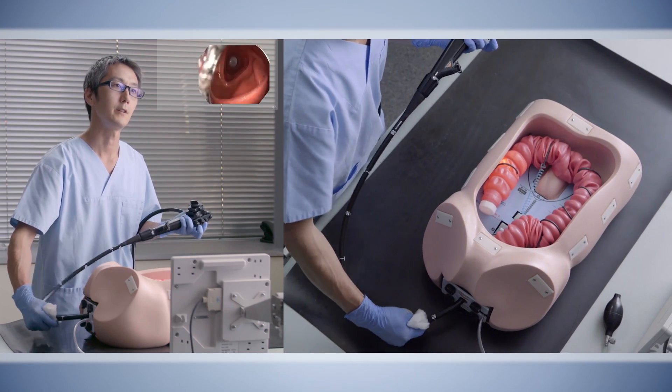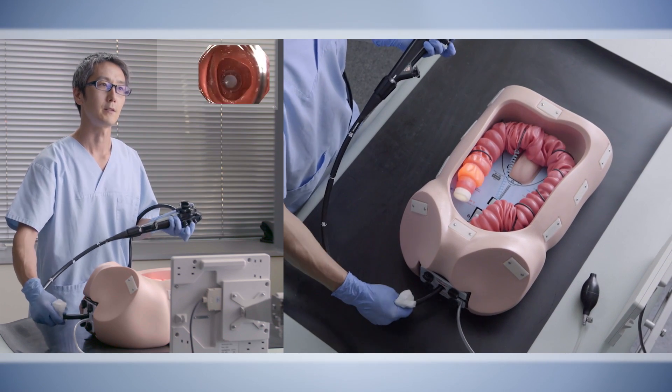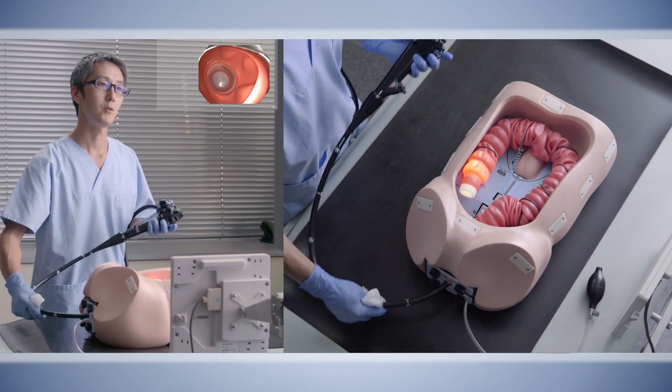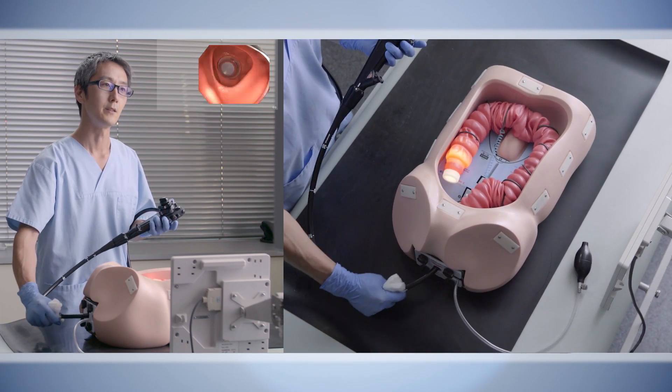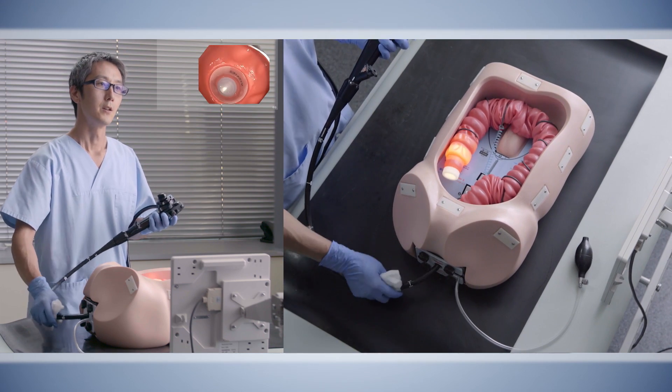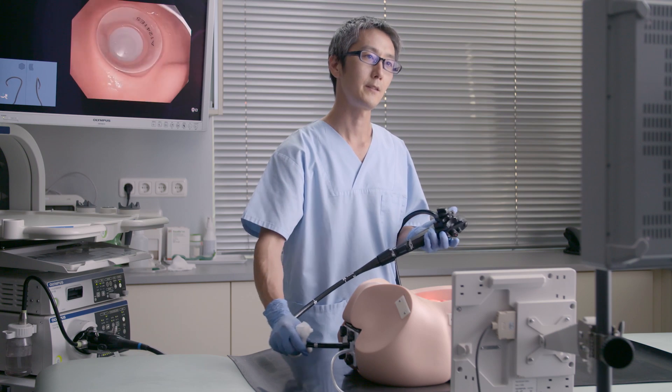After reaching the hepatic flexure, we insert the endoscope into the ascending colon, reaching the cecum, and finally confirm one-to-one again in the cecum. This is the end of all the exercises and Stage 2.